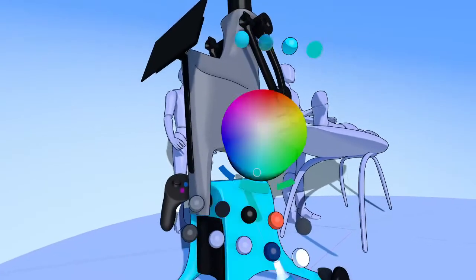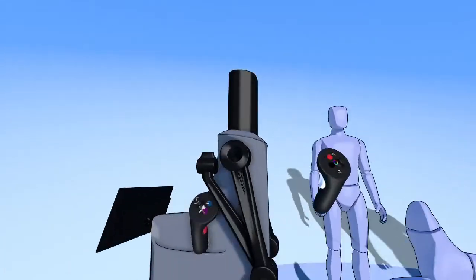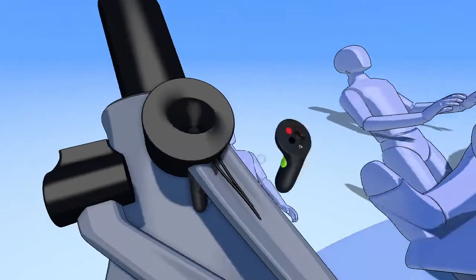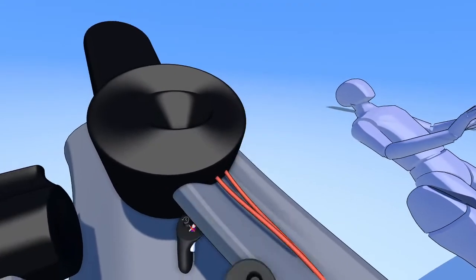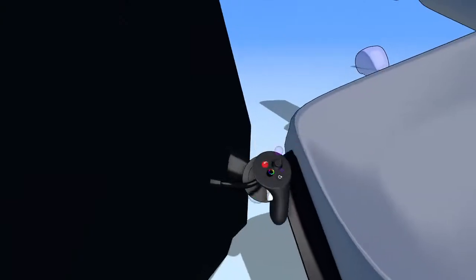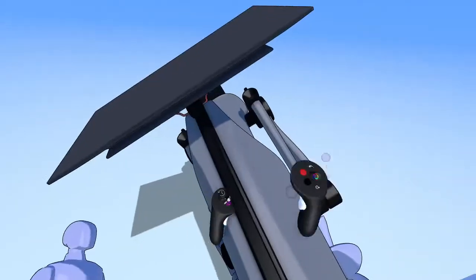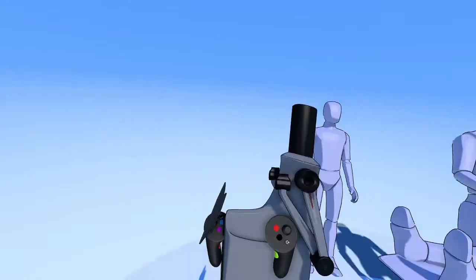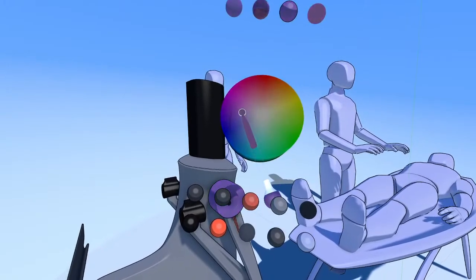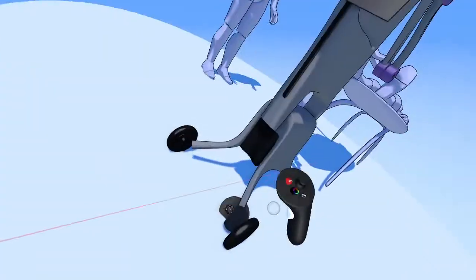And lighten up some of the body parts on it, like that. Oops. We'll go red on the wires again. Might be too red though. There we go, something like that. Okay, lighter on the screen. Let's go with some sort of dark purple on the joints. And on these little legs down here.